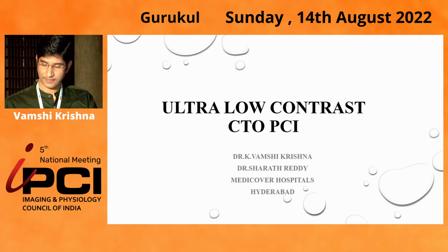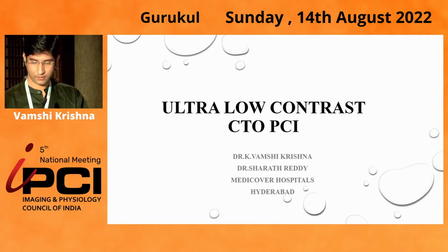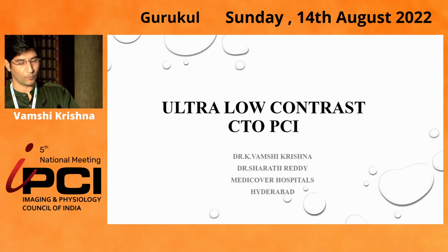The risk factors were that he was diabetic, hypertensive, and had diabetic nephropathy, for which his creatinine was around 3.73 and eGFR around 17 ml. On 2D echo, it showed global hypokinesia with moderate LV dysfunction, EF around 38%, mild MR, mild TR with moderate PH. And we planned for IVUS guided PTCA to RCA.